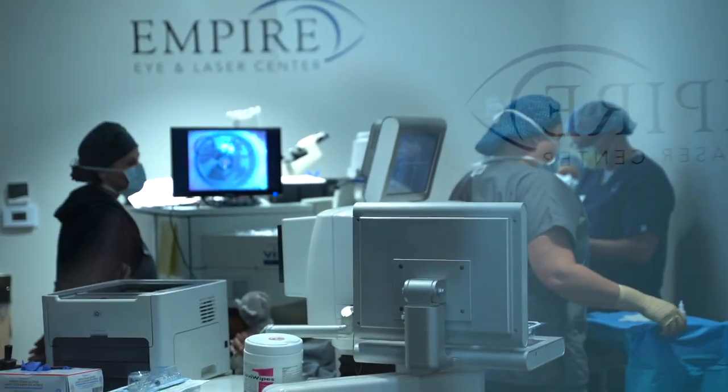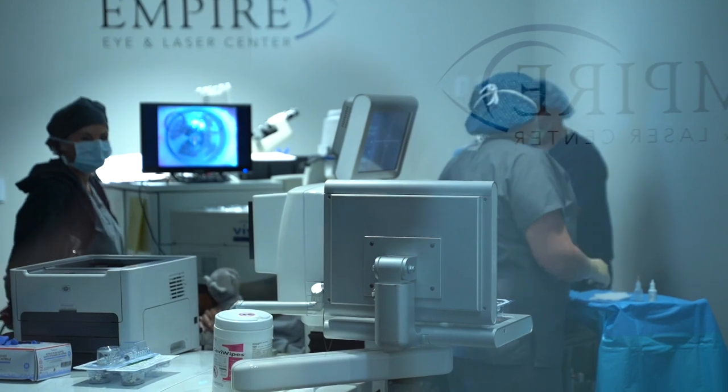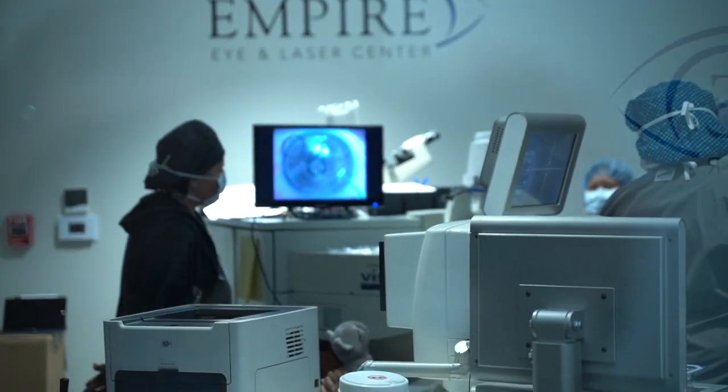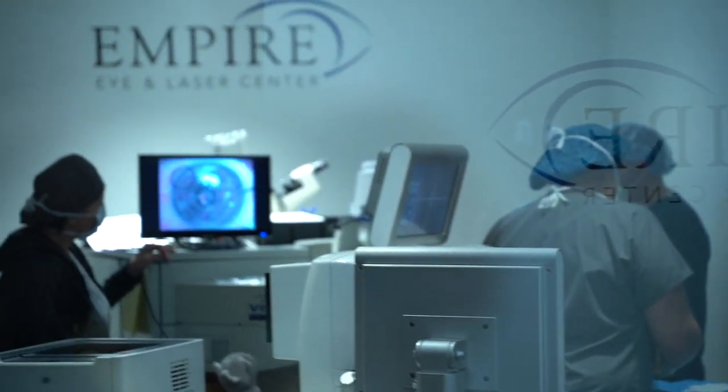Okay. The procedure's just starting here. They're getting me all prepped up. And it was pretty amazing. They were pretty fast. Surgery took only about 15 minutes, but take a look at what they're doing here. Just measuring the eyes.